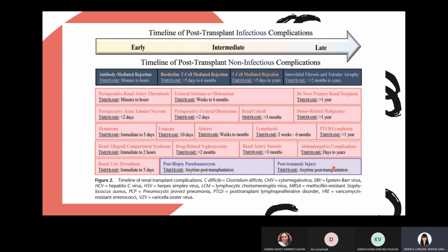Both patients underwent biopsy by our department, one right after the other, and the results of this patient came back, as I said, with acute tubular necrosis, and the other patient came back normal. The hematoma resolved, and the high velocities on the hilum went back to normal. So it's very important to know the risk factors of the donor and the patient before the surgery, so that we know what to expect once we are evaluating the kidney.